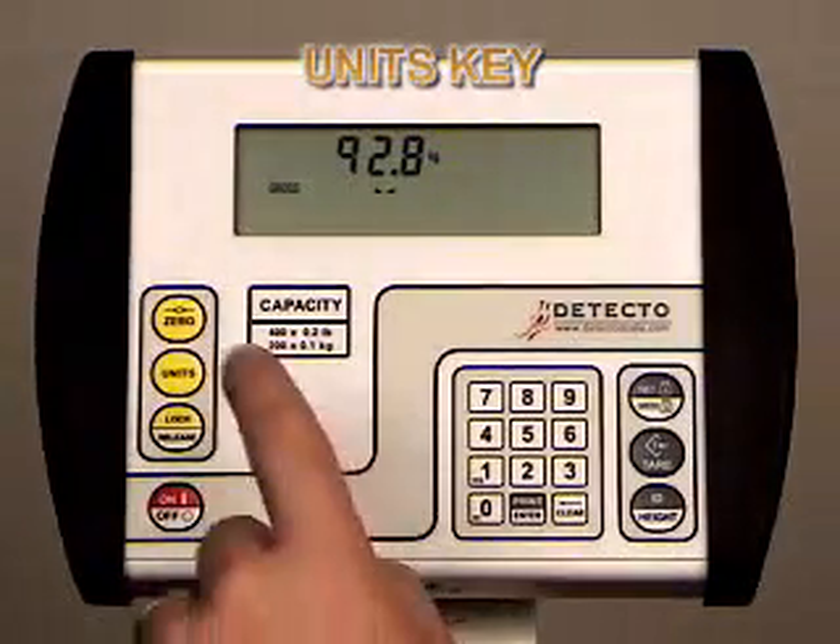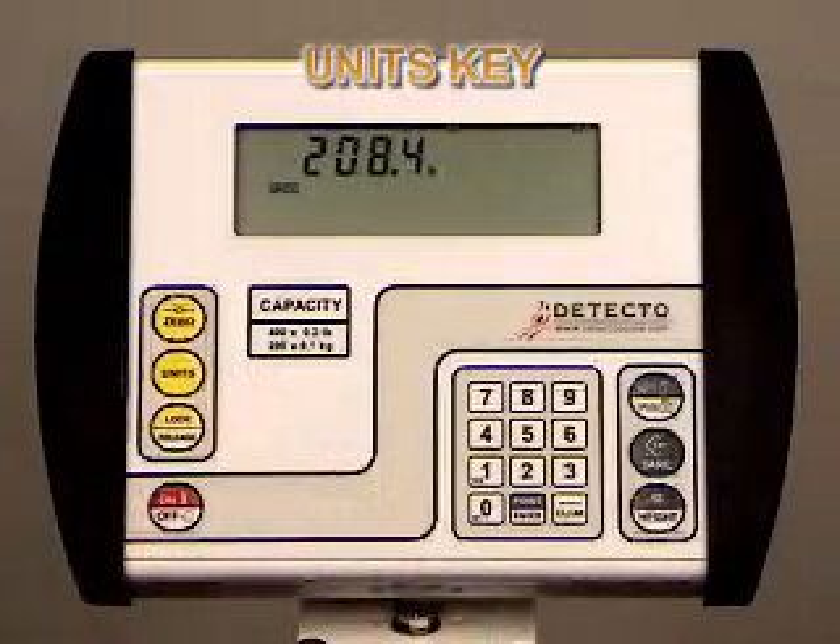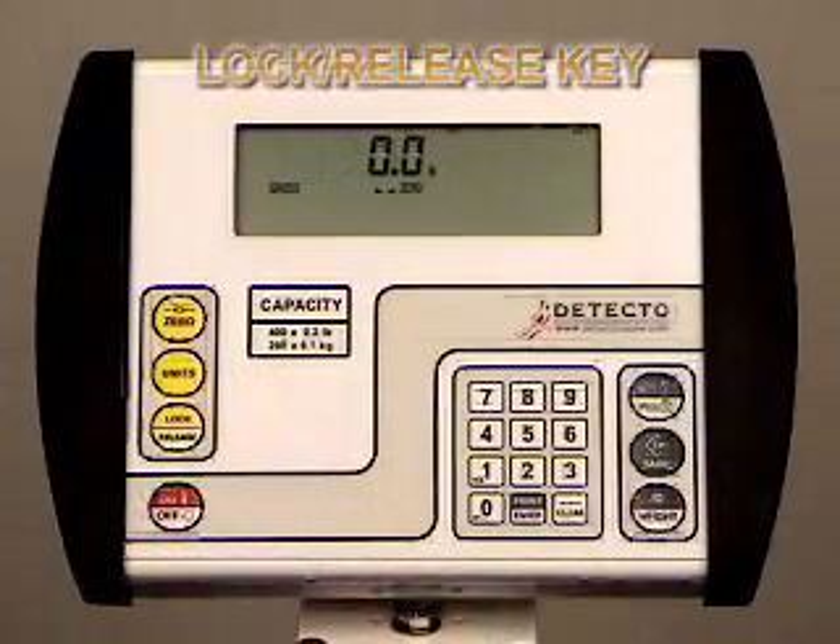To toggle units from pounds to kilograms, push the units key. To return to pounds, simply push the units key again.